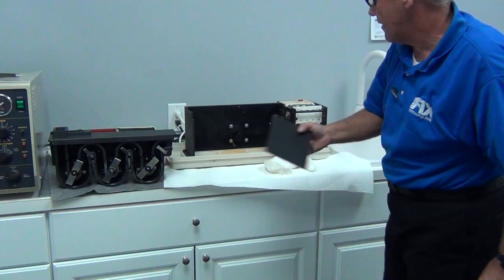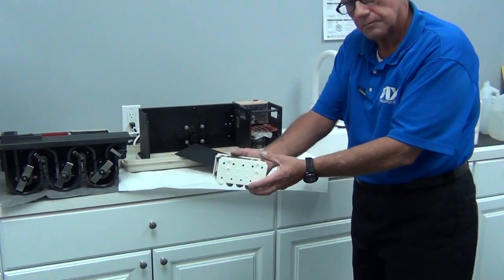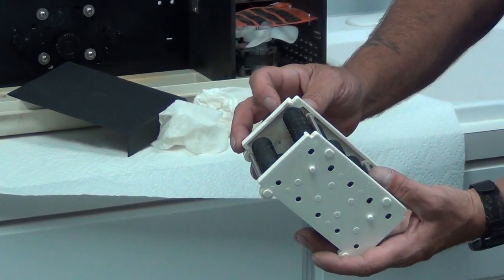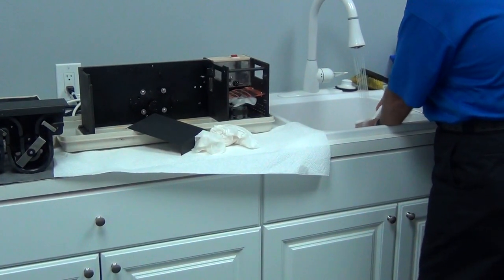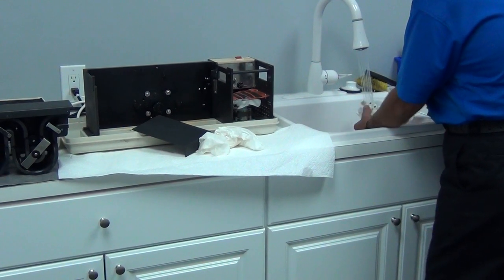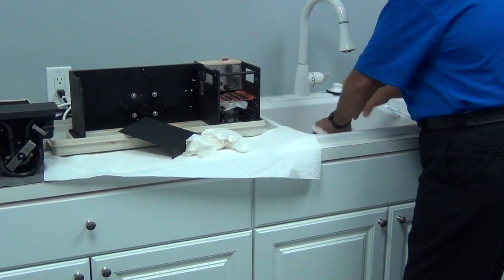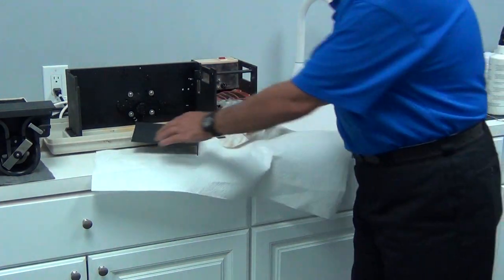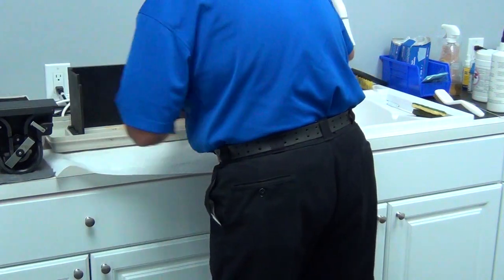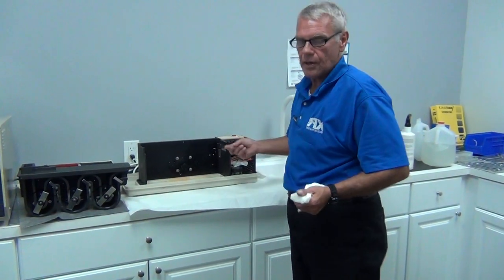Our next item of concern: we're going to raise the baffle after unplugging the processor, then pull the dryer transport out. We're going to turn it and make sure it doesn't have any debris on it — everything looks good. If necessary, it can be placed under a spigot and gently scrubbed, then shaken thoroughly, set aside, and allowed to air dry. If you want to facilitate the drying, the air side of the three-way syringe can be utilized, but it's much better to let it ambiently dry.